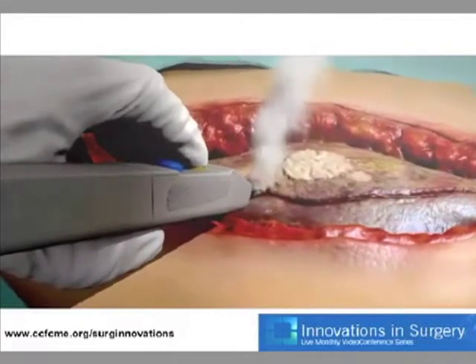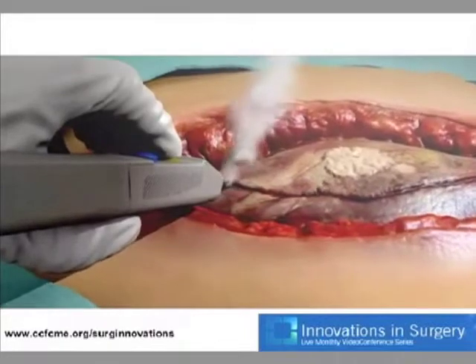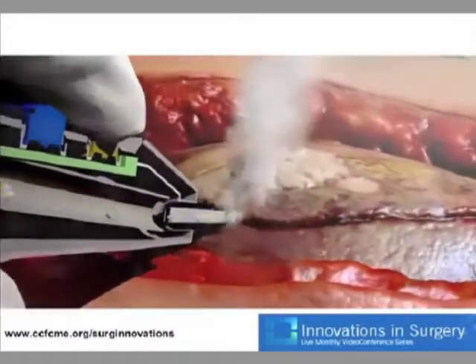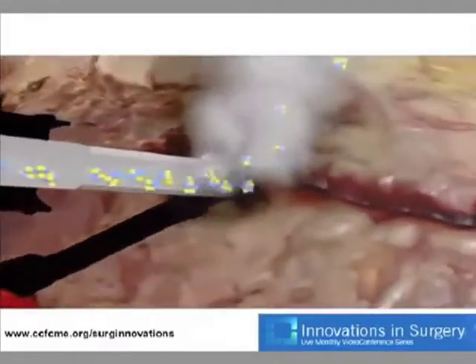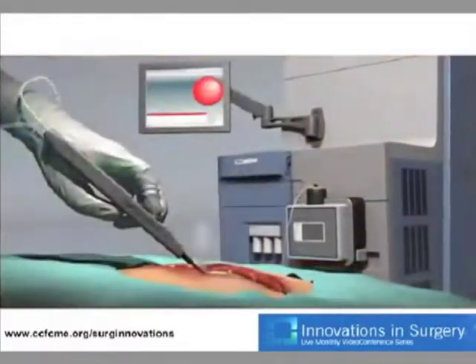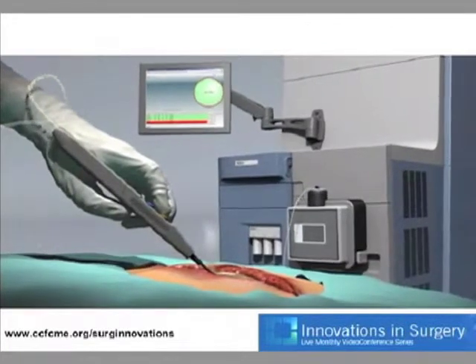Rather than discarding the smoke, we suck the smoke up through the instrument into the mass spectrometer, and we do that in about a hundredth of a second. A lot of the technology has gone into creating stable ion transfer, because the ions decay the further you go along the tubing to the instrument, and we need to keep them as stable as we can, and it creates debris and particulate matter which can block the machine. So quite a lot of technology has gone into it. But the feedback to the surgeon is near instant.